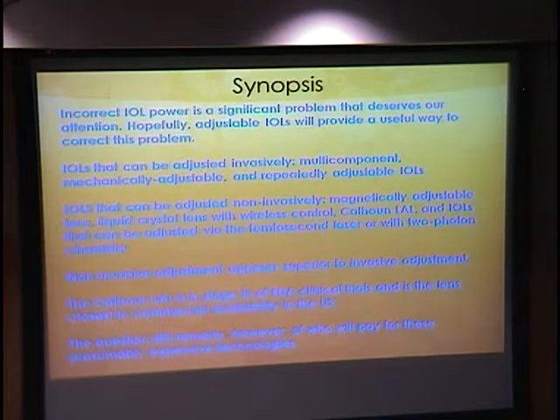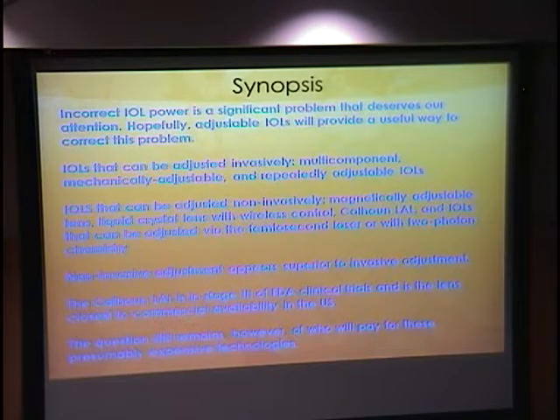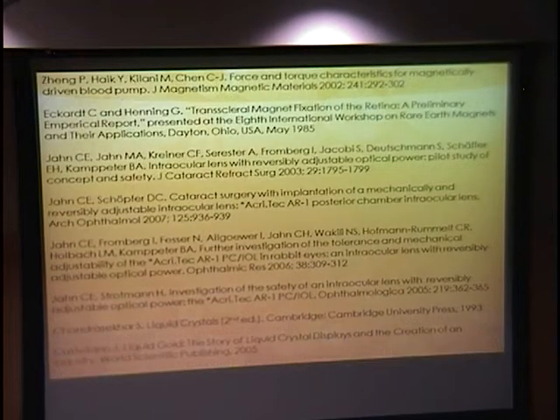However, and I know I'm opening up a Pandora's box by concluding on this final statement, who's going to pay for these technologies? These are very expensive technologies. I have tried to get some financial data from Calhoun for the light adjustable lens. They're keeping their lips shut on that, but I was able to find in various papers from Europe that the light adjustable lens costs about $1,500 for patients in Europe. The digital light delivery system costs on the order of $80,000 to $100,000, so that's a very expensive endeavor. You also have to consider all this femtosecond laser technology. Those things cost on the order of half a million dollars, and who knows, upwards of $70,000 for annual maintenance fees. I couldn't get from Calhoun Vision how much the maintenance fees would be for their digital light delivery system. So these are all my references.